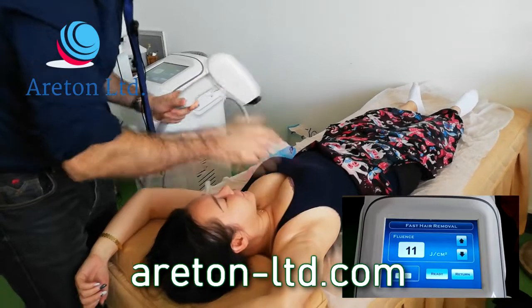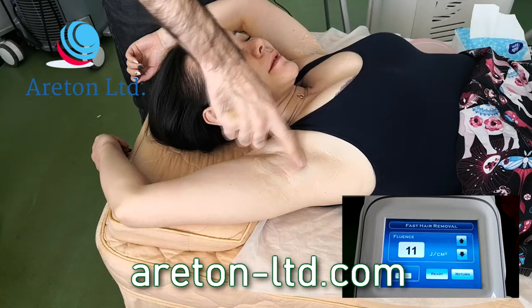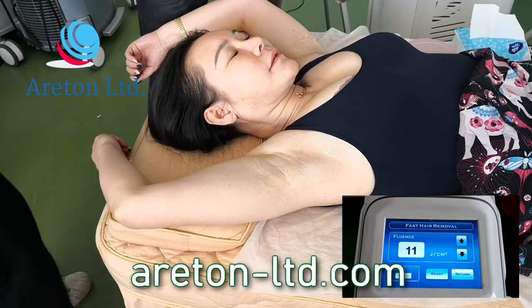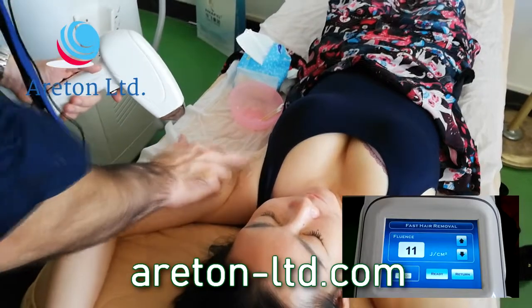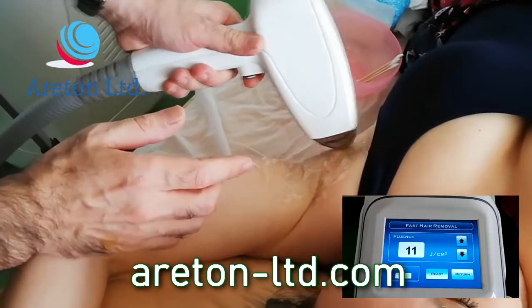Just going to go and do it for the last time. Actually touch it, it's quite warm, so we are done with this area. So if I go touch here now, here is quite warm and here is very cold. It's because I haven't done a treatment. So we're going to do the treatment here, and you can see how fast it is. I'm going to do it with my left hand.